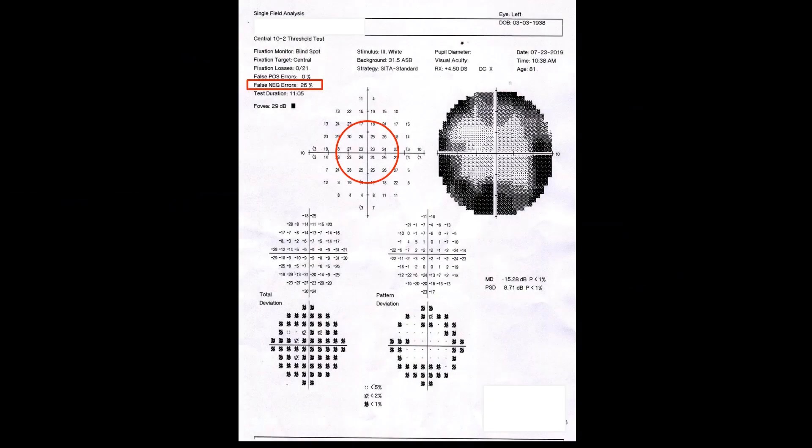This visual field has high false negative responses and the best sensitivity is at four primary points. There is a patchy reduction of sensitivity towards the edge. This results in a cloverleaf pattern in the grayscale which is due to patient's inattention as the test progresses.